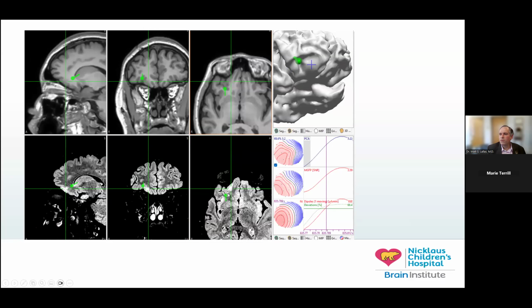And this one, if you ask me, I think is actually much more a candidate based off of the location and orientation data, as I mentioned. But one of the things to also understand is that we are dealing with a number of areas where our typical opinion of the cortical organization may be abnormal. And so we may be dealing with some altered closed fields, and we may be having a hard time getting perfect localization. But in general, we've got a number of very specific target tubers, and this would be the one that I would be most concerned about. I am not at this time going to be able to tell you if I'm right. Maybe one day in the future.